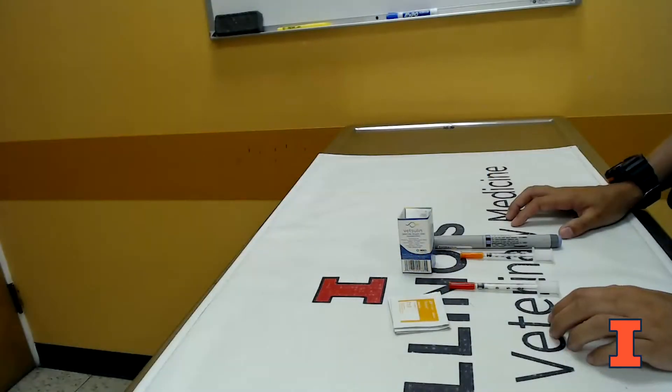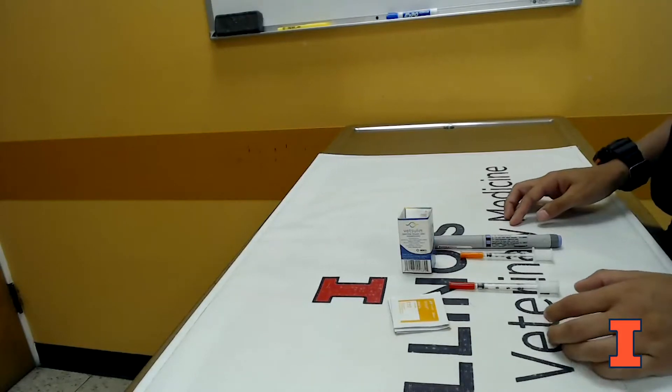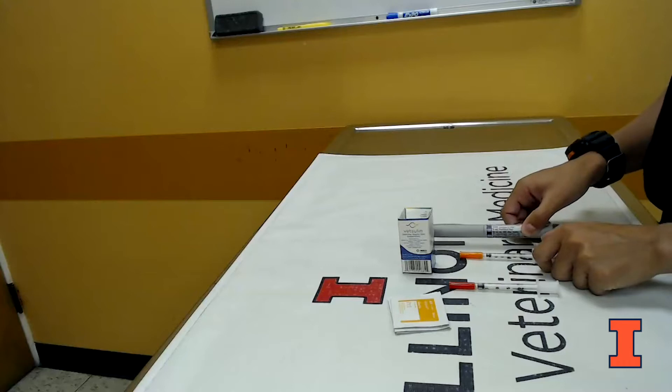Today we're going to go through some different types of insulins and how you would draw these up and administer them to your pet. In veterinary medicine, we can use human insulins or veterinary specific insulins. The examples we're going to use today are this Lantus insulin pen, which is a human insulin often used in cats.